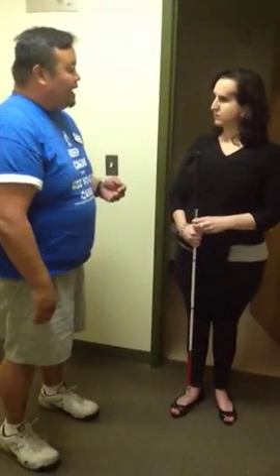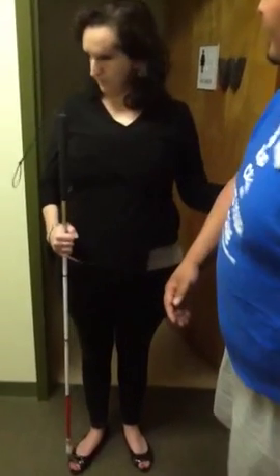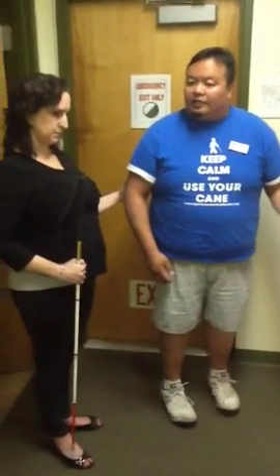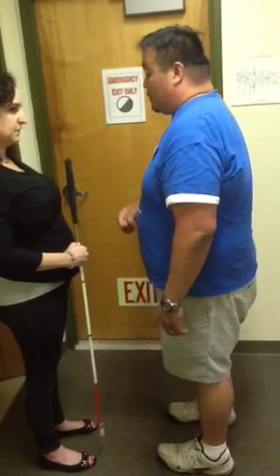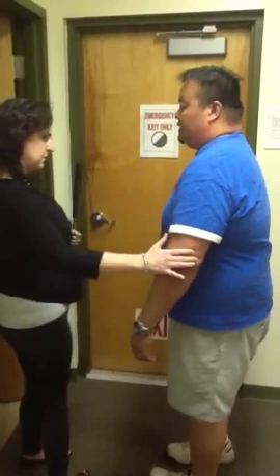Now, the reason I'm stopping here is because we're going to move on to a second portion, which we kind of did on the way here, where we did human guide and you were holding on to the cane. If I was to offer you human guide again, you would see how you're holding your cane on that side. Just like when we did an about face, you're going to do the same movement, but just with a cane. If we do about face, I'm going to stop, put your arm down, I'm going to look at you, you're going to switch hands with your cane, then we're going to turn and come back. So let's turn back at each other, switch hands, grab, okay, that's like so.